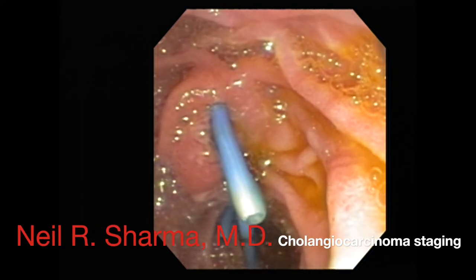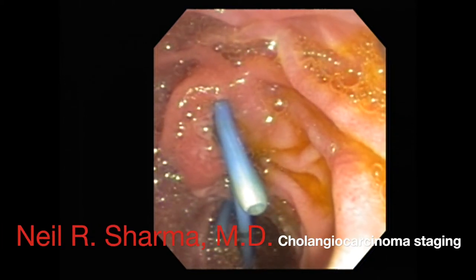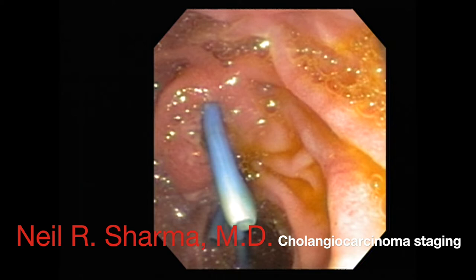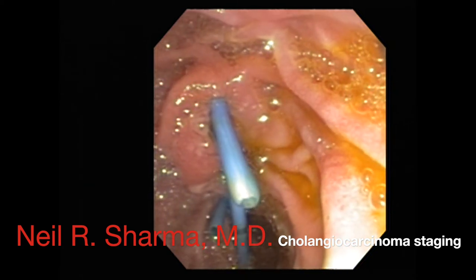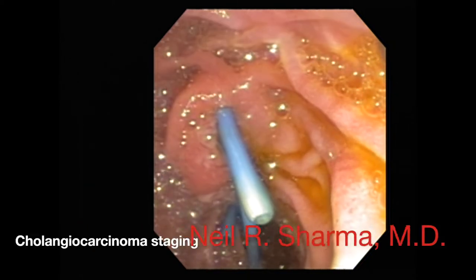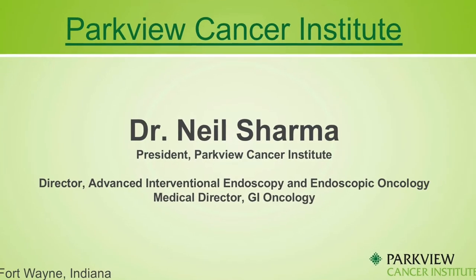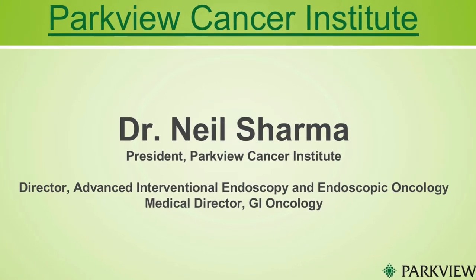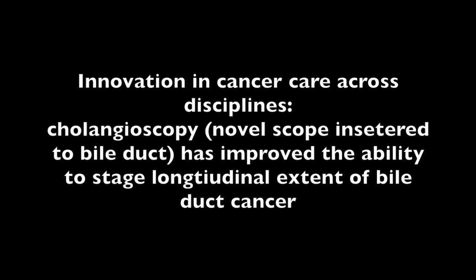In this video, we discuss the role of cholangioscopy in the staging of bile duct cancers, otherwise known as cholangiocarcinoma. We will emphasize the role of staging of cholangiocarcinoma in order to define ability for surgical resection.